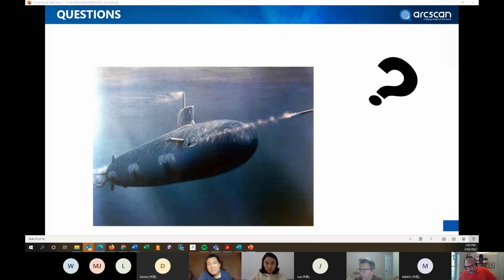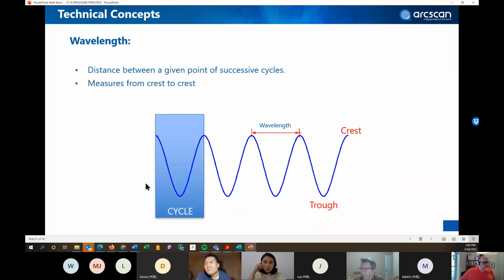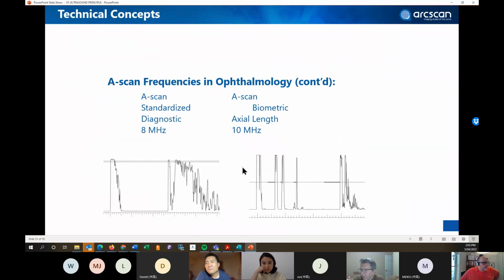Okay. And if you were to show one of your first slides, where you showed how we measured peak to peak, the other images showed kind of a sinusoidal wave, and they're rounded peaks. They're not sharp peaks. So where's the very sharp peak of that? In a light wave, it's rounded on top. It's hard to find that top point. In the ultrasound, they're very sharp peaks. And you showed that in a previous slide. See how sharp those peaks are?